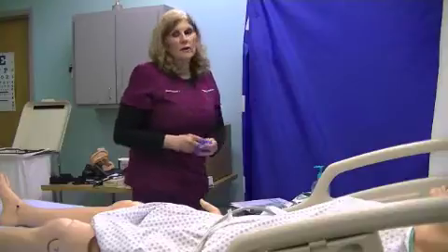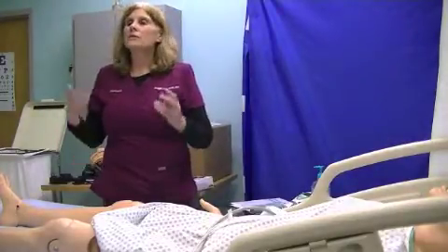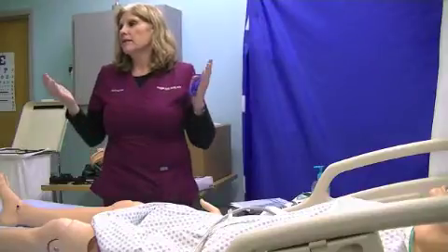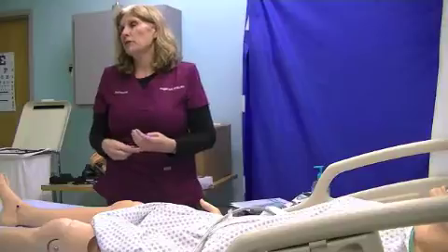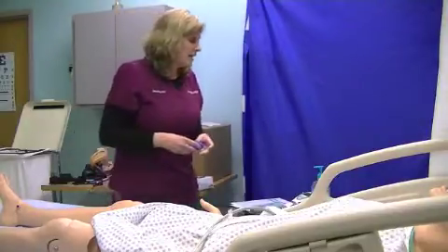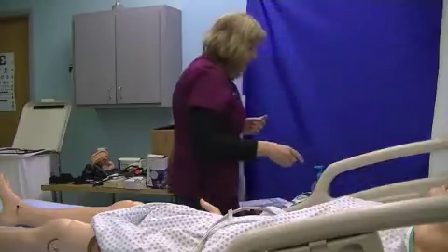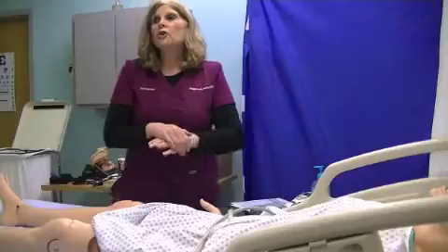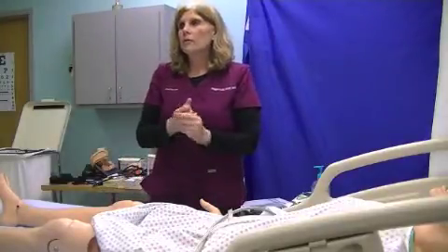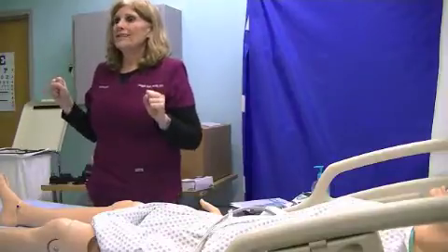Now, one good thing you can do is have them take a deep breath as you insert the rectal thermometer. That helps the sphincter relax and makes them less stressed. Most of the time, like I said, we're not going to take a rectal temperature unless it's an infant or somebody who had oral surgery or couldn't do it, who is unconscious or confused. And make sure you hold on to the rectal thermometer, because when you put something in the rectal area, it makes people want to tighten up.